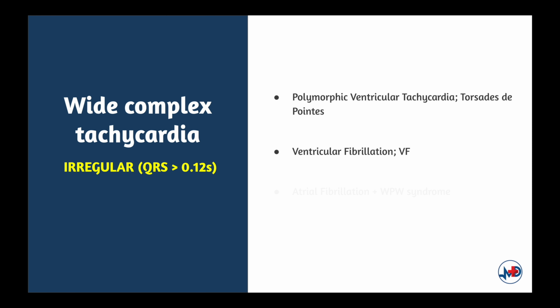Next is the wide complex tachycardia which is irregular. What we'll be covering here include polymorphic ventricular tachycardia or torsade de pointes, ventricular fibrillation or VF, and atrial fibrillation with WPW syndrome.